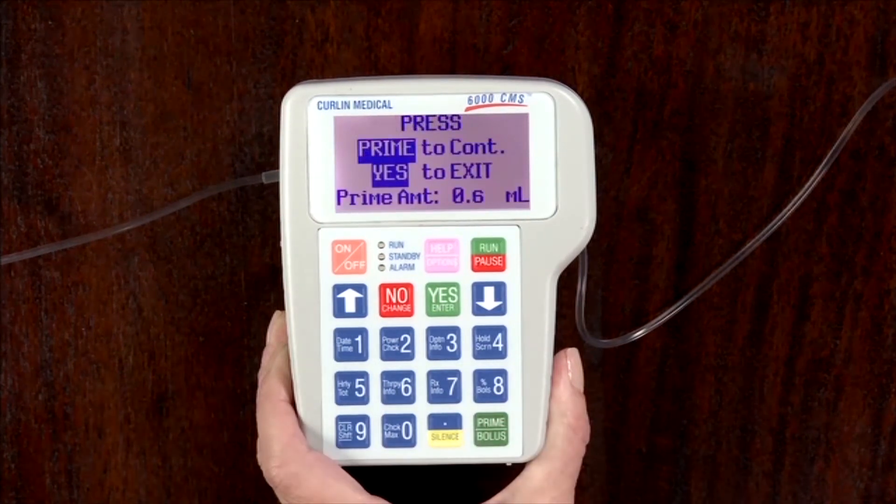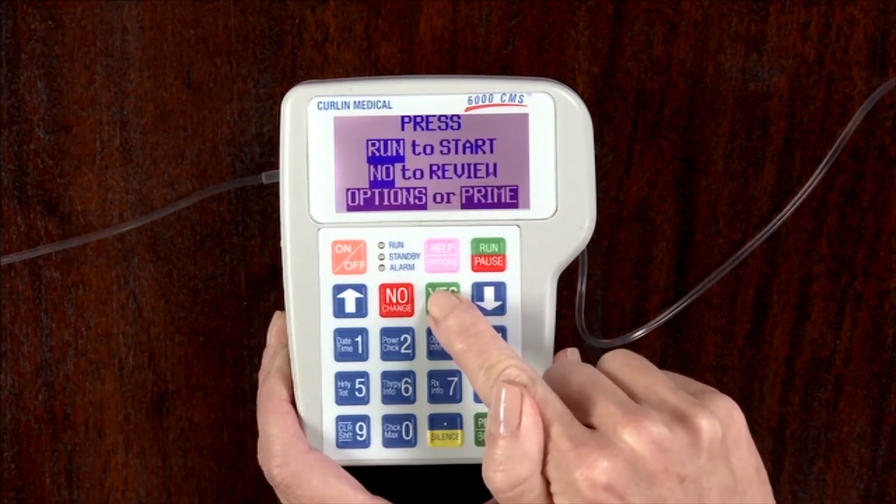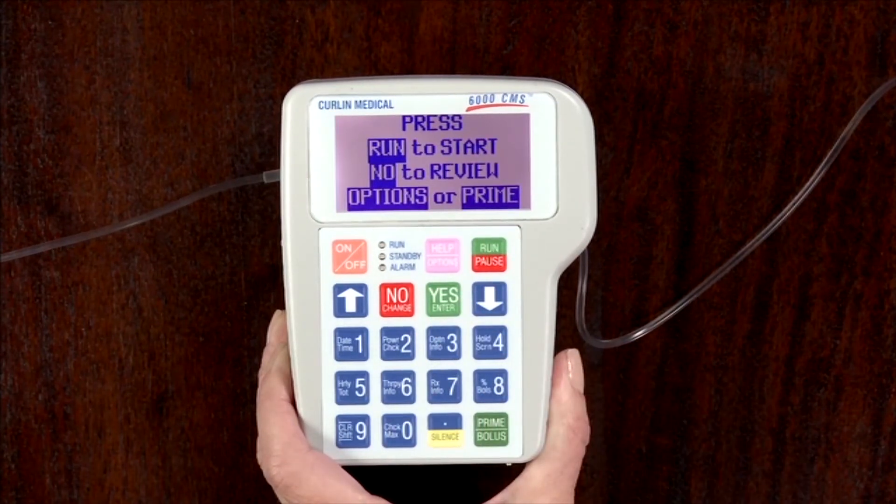Once the priming is complete, press the yes key to exit. Refer to chapter 3 for important information about priming filtered sets.